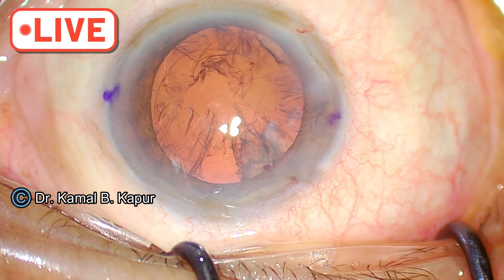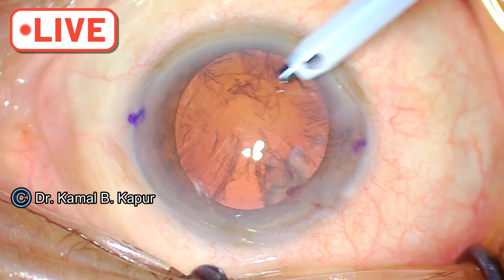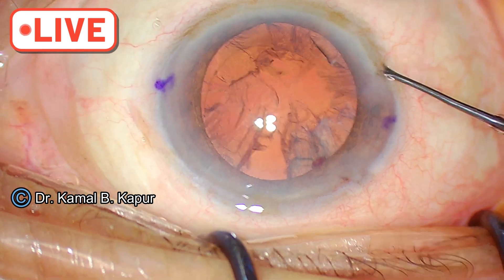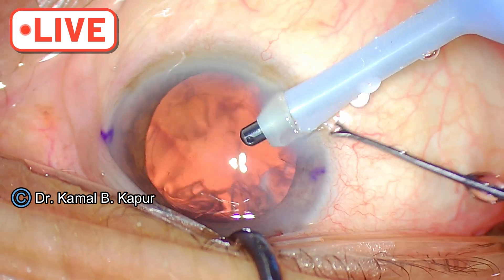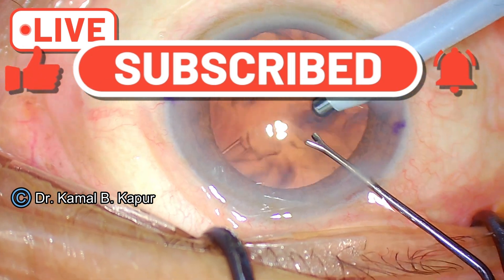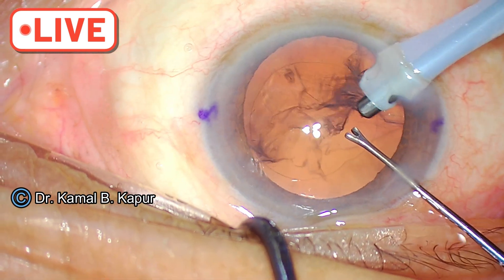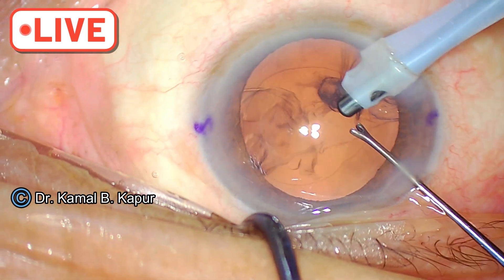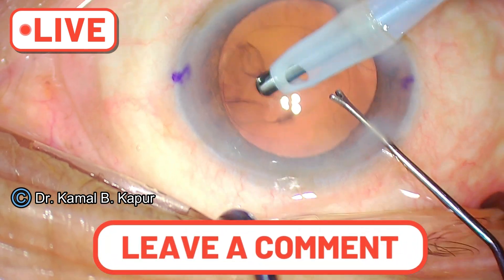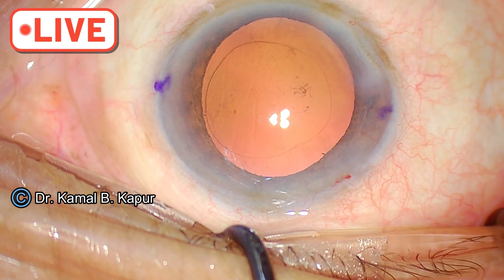So the tricks to remember: first, estimate the right amount of FACO power. Angulate the FACO tip at 35 to 40 degrees to the plane of the nucleus. Before you do that, aspirate the floating cortex on top of the nucleus. Once you have a depth of approximately one and a half to two FACO tips embedded into the nucleus, go with your FACO chopper approximately one millimeter in front of your advancing FACO tip, embed vertically downwards. Then separate your FACO chopper towards the left and your FACO tip towards the right, and you will achieve a beautiful chop.